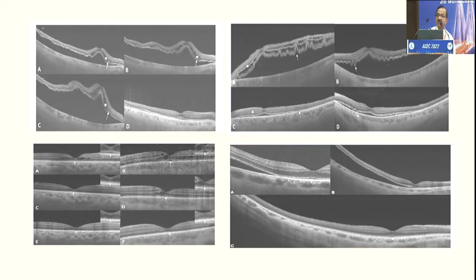It's an outside-in approach, where the RPE pump is relied upon, contrary to inside-out as we do in vitrectomy and fluid-air exchange, where there is high surface tension and high buoyancy, and that can cause what we just discussed in the form of retinal displacement. Whereas retinal displacement does not happen with pneumatic retinopexy, as these swept-source OCT studies have shown.